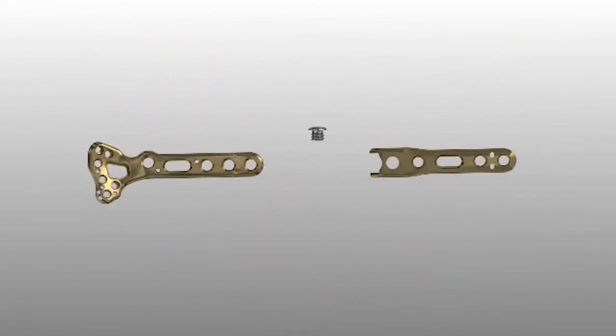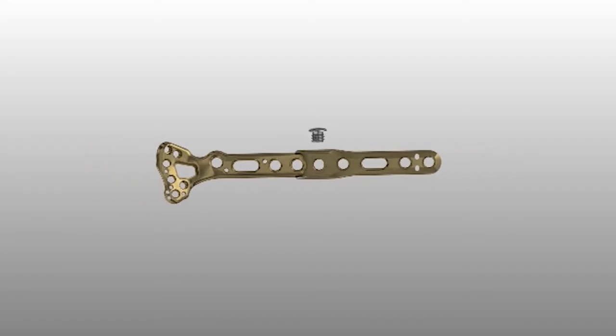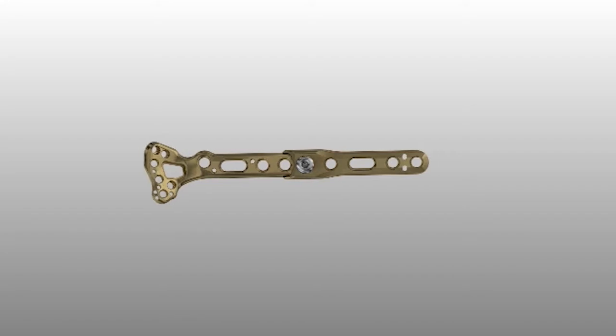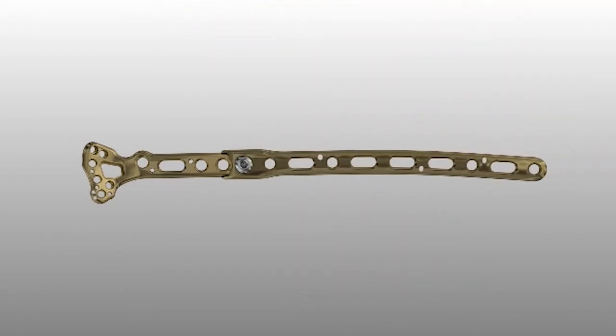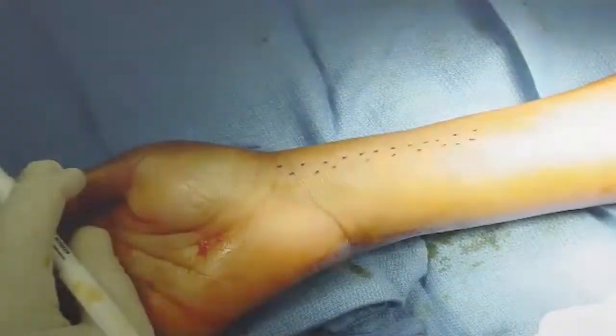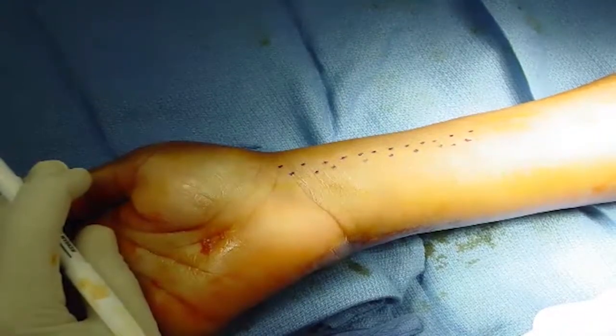The first is the neutral extension plate, which extends the Acculock 2 proximal VDR plates by an additional 43 millimeters and can be used on both the left and right VDR plates. Left and right specific long extension plates are also available and extend the Acculock 2 proximal plates by an additional 111 millimeters. The patient's forearm is supinated to expose the surgical site.